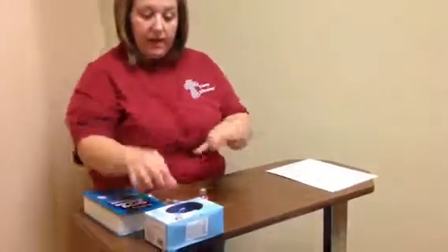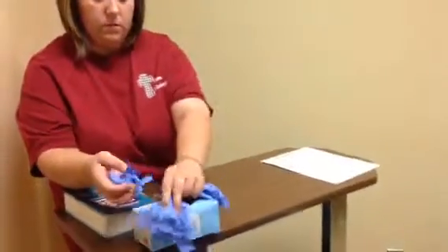At this time, I would perform my hand hygiene. So I would go and wash my hands. So I've washed my hands. I come back. I'm going to apply some gloves.